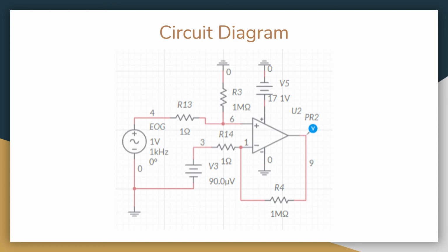During REM sleep, sufficient eye movement should be present, but there should be no K complexes present. So, in order to interpret this part of the data, the interpreter must reference the first circuit that measured K complexes. This circuit contains a large gain, but since the op-amp is saturated at 1 volt, the positive data will be maxed out at 1 volt, and the negative data will be set to 0.